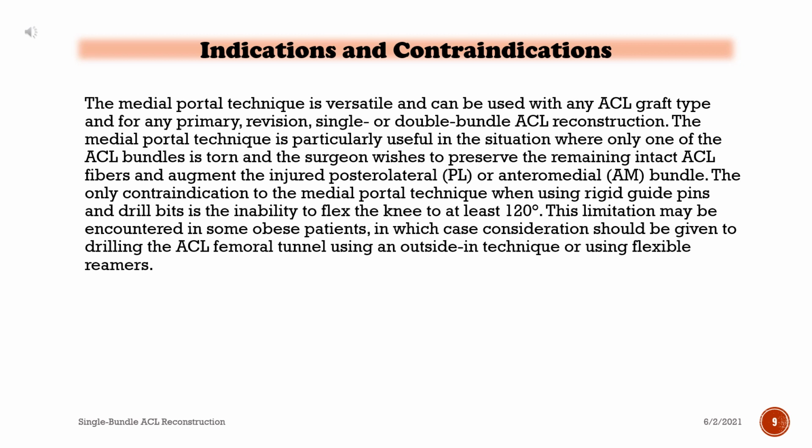The only contraindication to the medial portal technique when using rigid guide pins and drill bits is the inability to flex the knee to at least 120 degrees. This limitation may be encountered in some obese patients, in which case consideration should be given to drilling the ACL femoral tunnel using an outside-in technique or using flexible reamers.